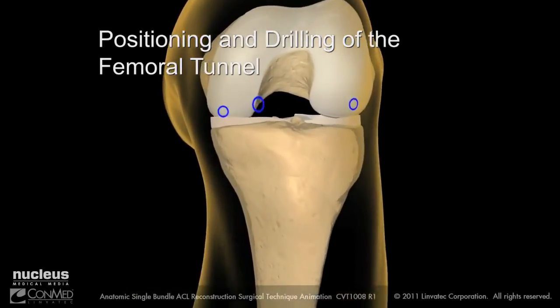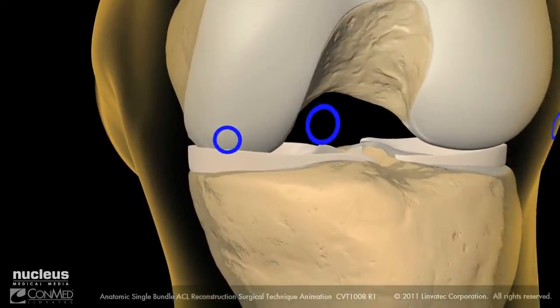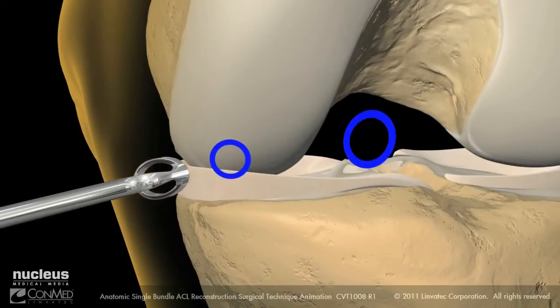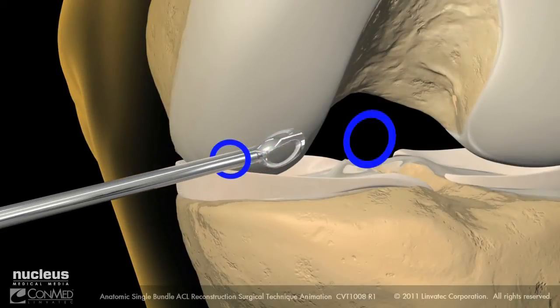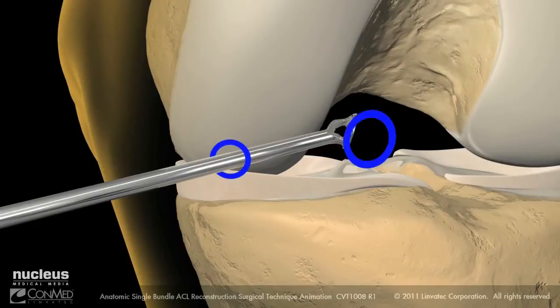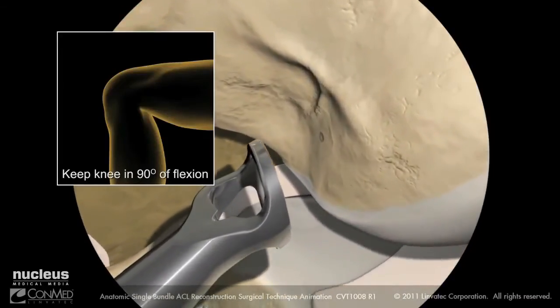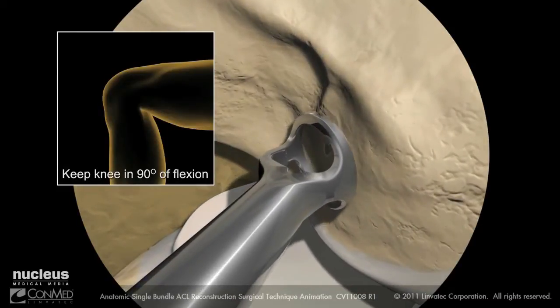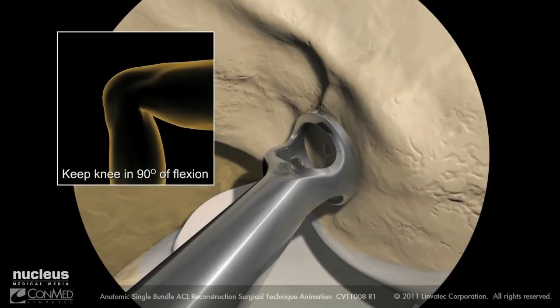With the ACL footprint identified and the center marked, insert the bullseye femoral footprint guide into the accessory anteromedial portal with the knee flexed at 90 degrees. Place the guide at the center of the ACL footprint. Once the correct position is achieved, advance the guide pin into the femur a few millimeters to notch the bone.